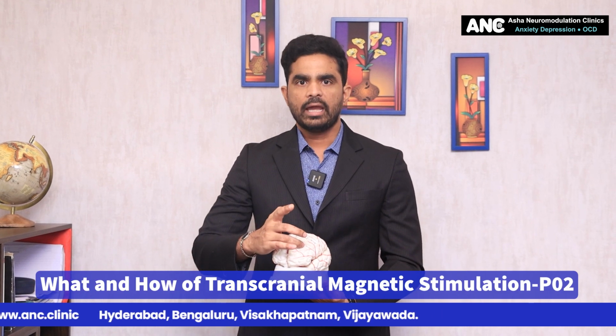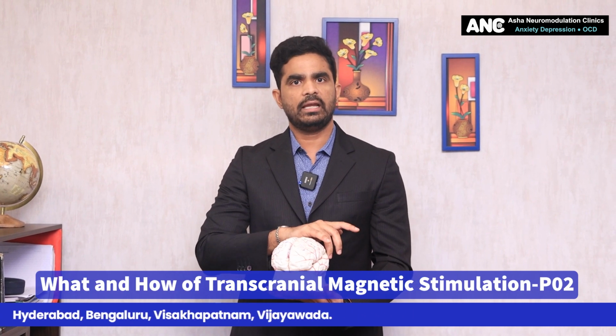When I am stimulating a particular brain area, because action potentials travel and they go to different distant areas in the brain, they activate those parts of the brain also. Alright, and the third effect in the classical effects is that when I do this repeatedly, it's not a question of just a single session or a single exposure.